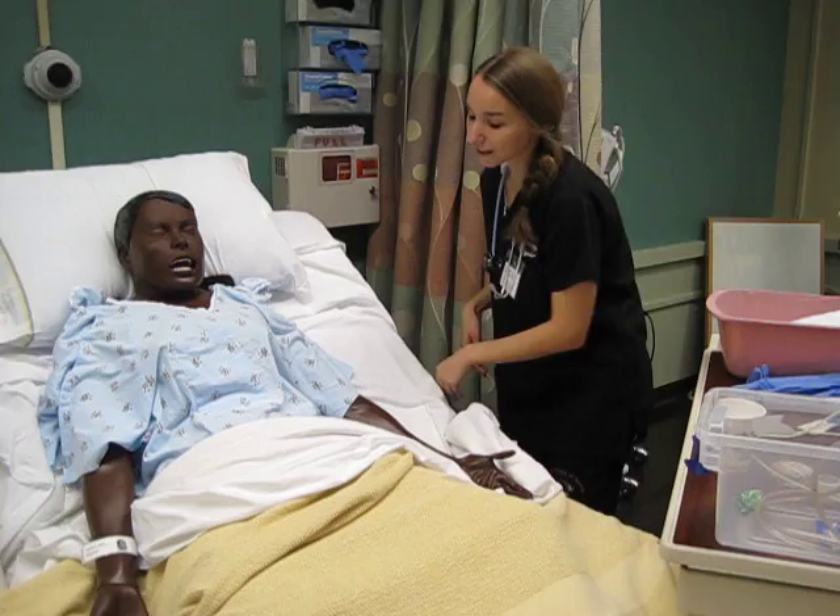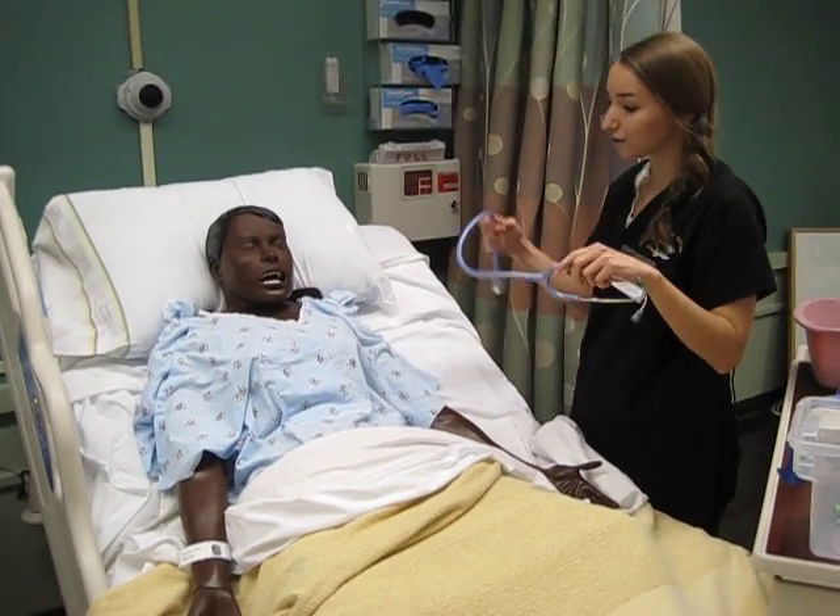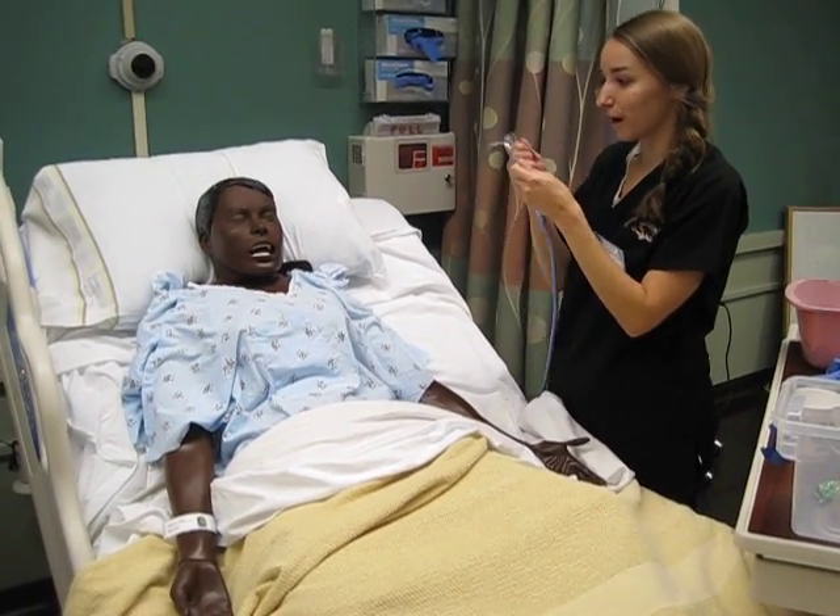The first thing I'm going to do is listen to some bowel sounds and your lung sounds just to make sure that once we get the tube down, everything will be working properly.